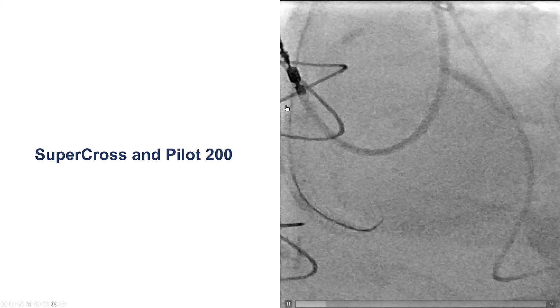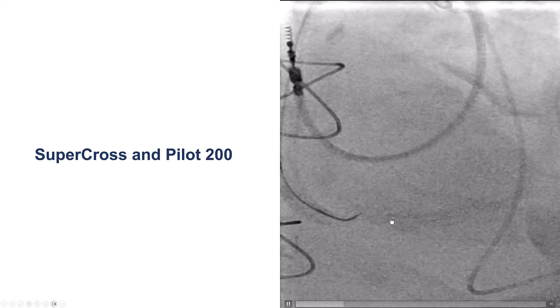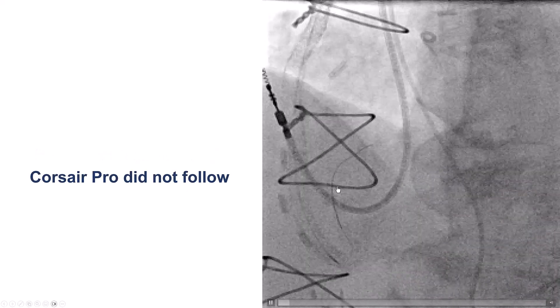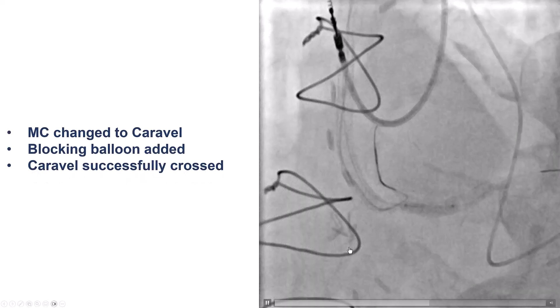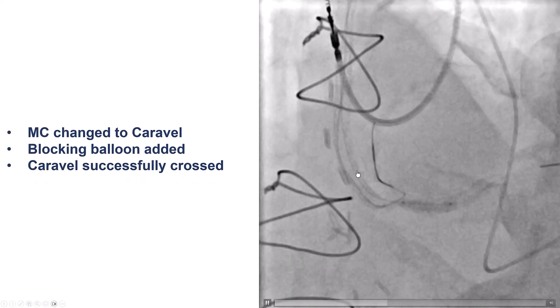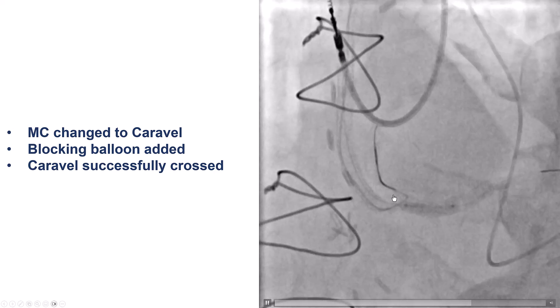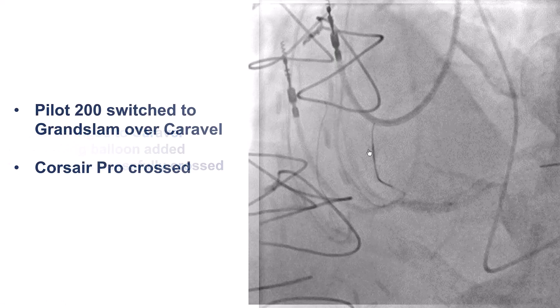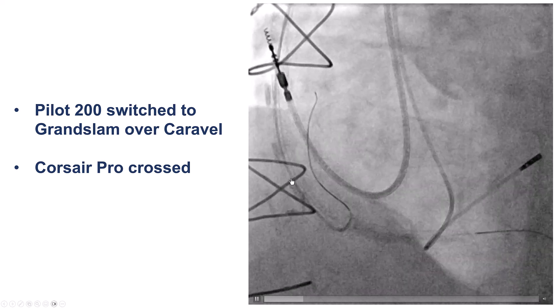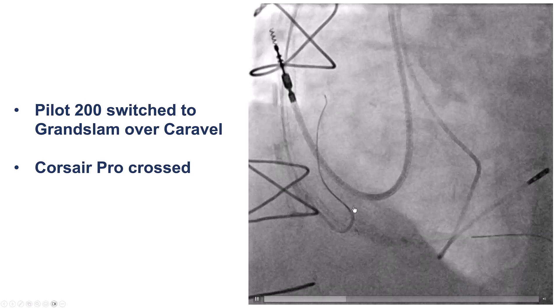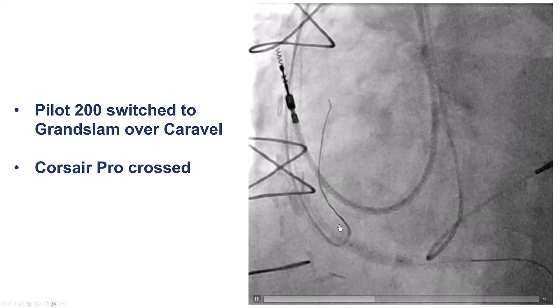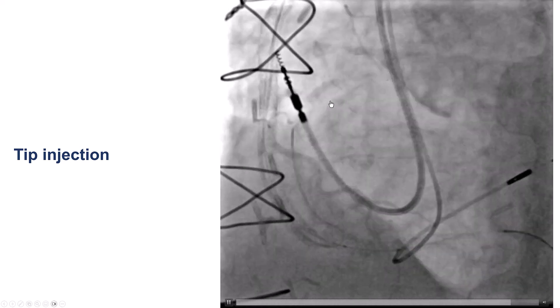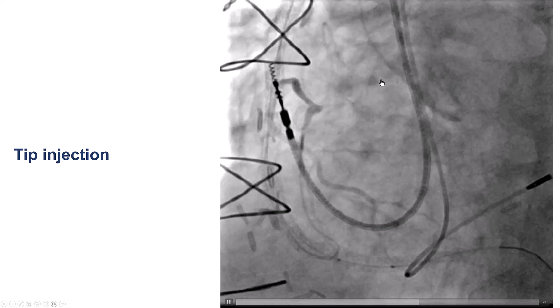Similar to the previous attempt, we went retrograde through the saphenous vein graft. We used an angulated Supercross microcatheter, but had difficulty advancing the retrograde equipment because of the previously placed stents. Eventually we were able to use a blocking balloon, switched to a Caravel microcatheter, and advanced the retrograde microcatheter into the mid-right coronary artery. We then delivered a more supportive Corsair Pro microcatheter retrogradely. We still had some length of patent vessel until the ostial occlusion.